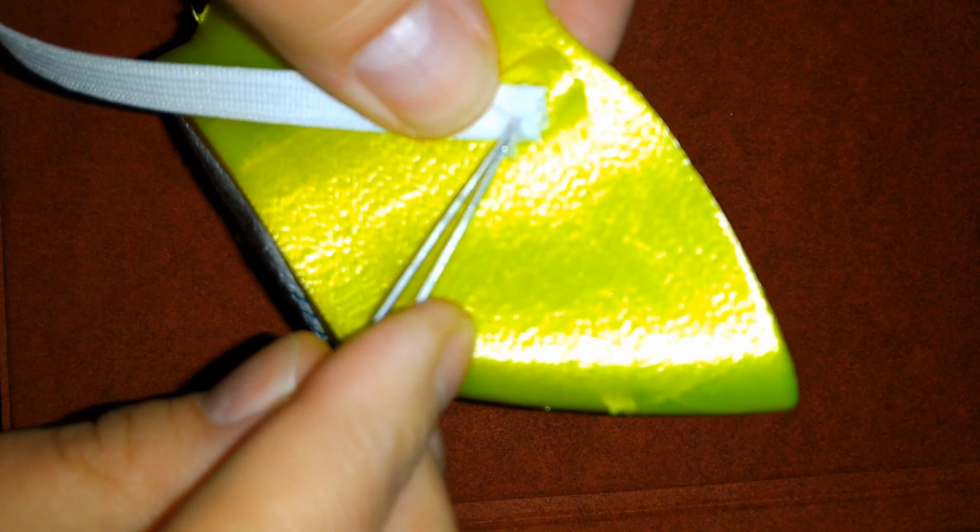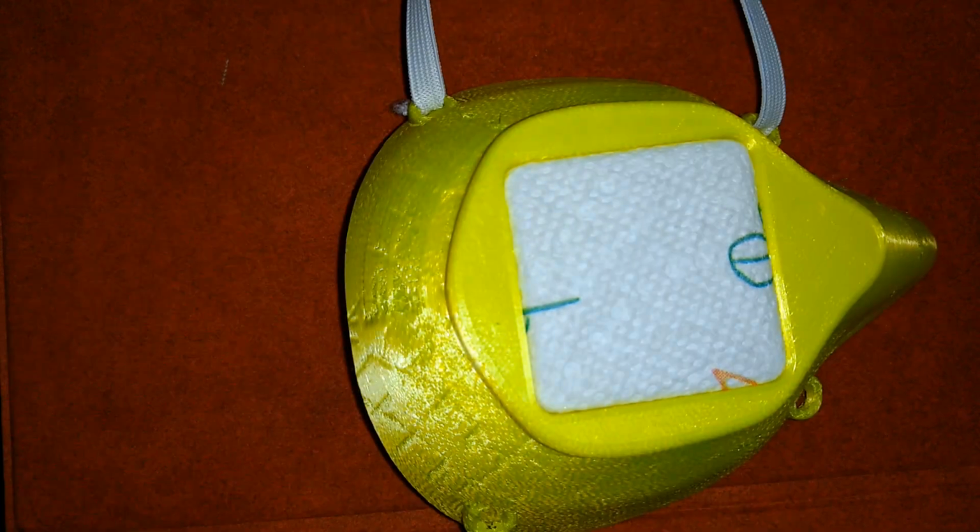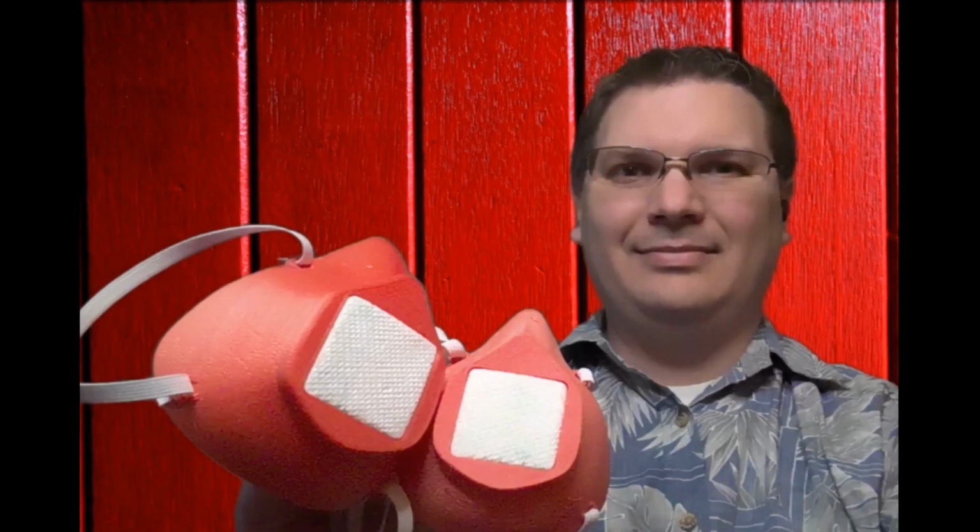So what we're going to do is form a loop. We're going to go to the other side, and you'll see this one goes in a little bit easier. You just pull that loop through, and very easily the elastic band is there. And so you'll do the same thing on the other side. And now you just wrap that around your ears and you have yourself a mask. Super, super simple. Just those two steps. Filter in and put the loops in.